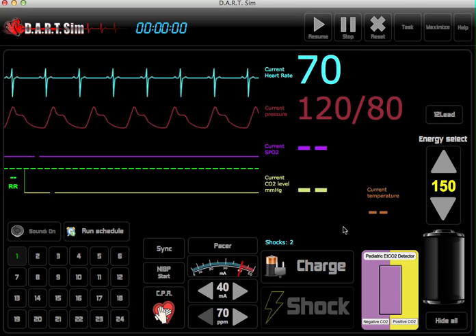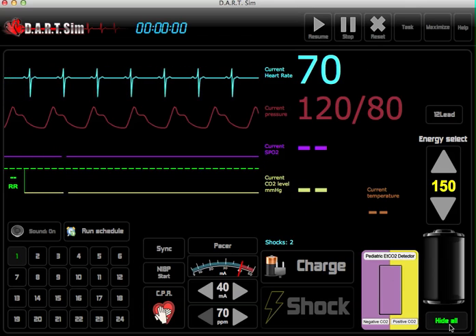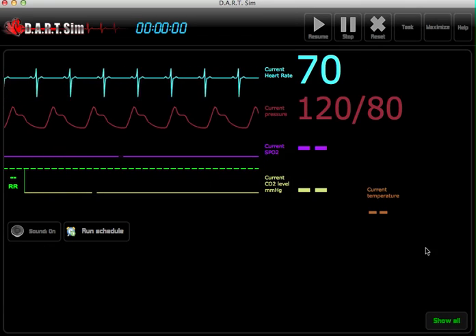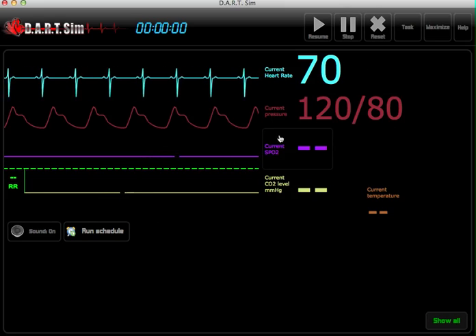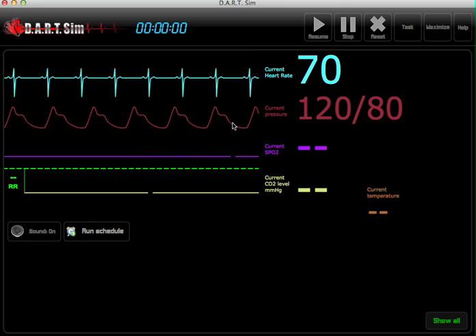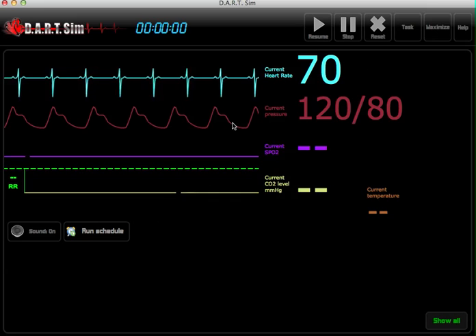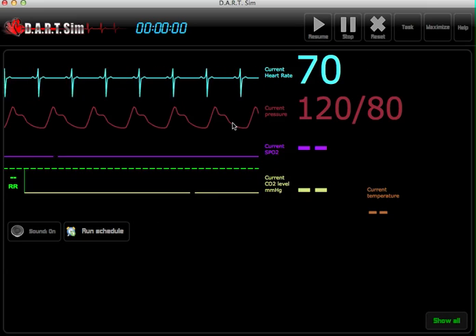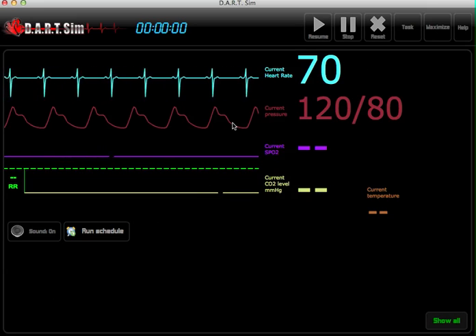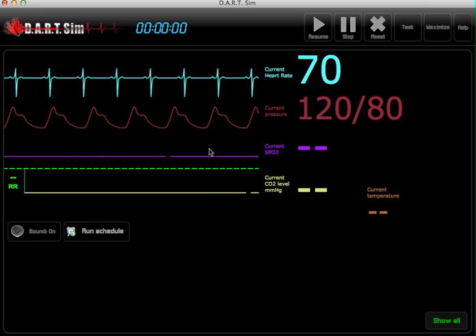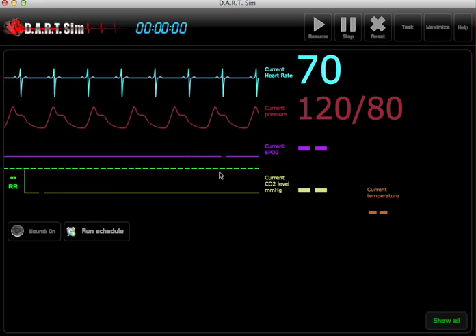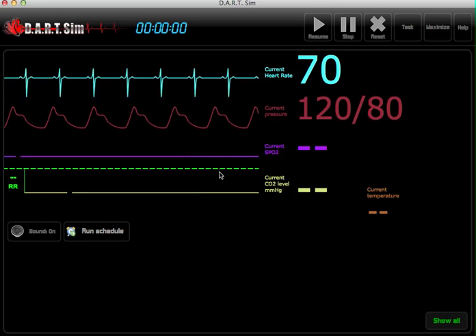You also have the option of hiding all the functions if you want to use the DART Sim strictly as a cardiac monitor. And if you want to use your own defibrillator equipment, you can still utilize that and use ours just for display only — so that's another option.